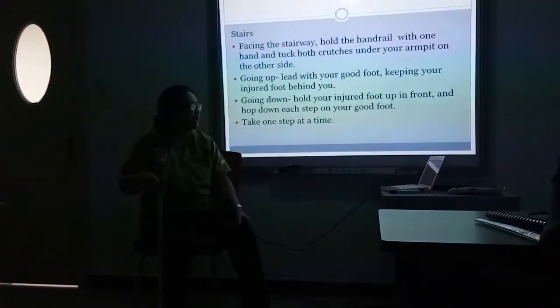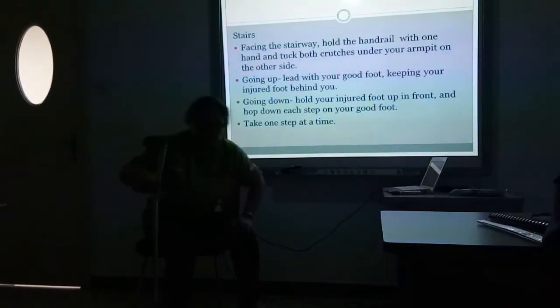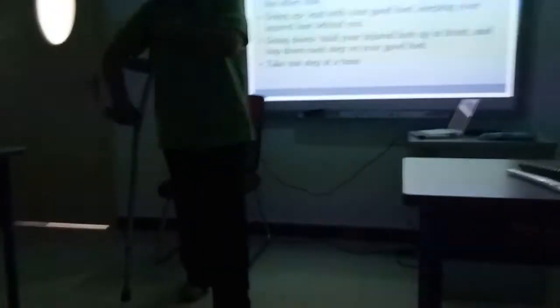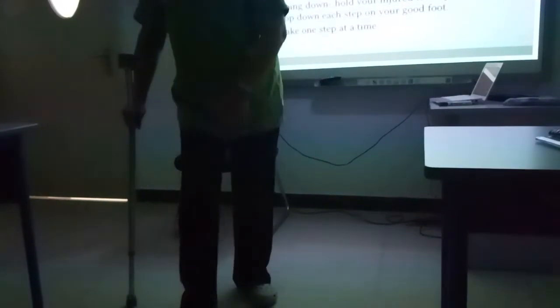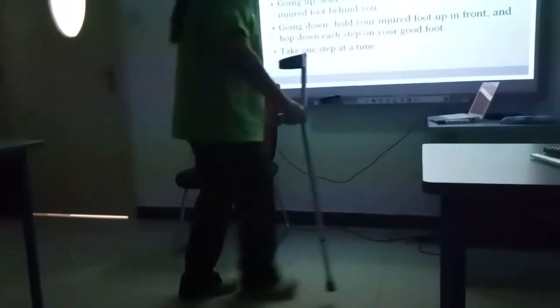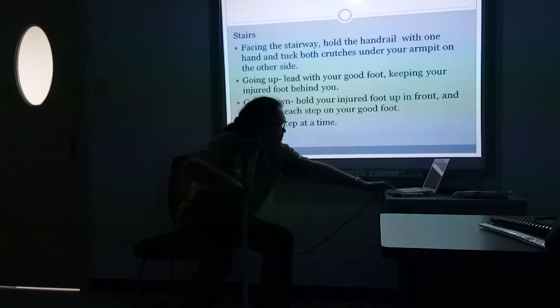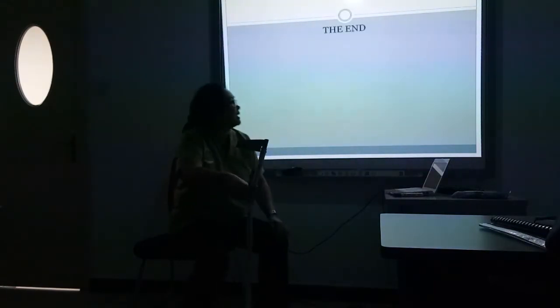Okay? Keeping your injured foot behind. So, pag itong injured, itong una mong iganyan sa stairs. Okay? Tapos, ito, ganyan. Ayan. Then, take one step at a time. Okay, hindi sabay-sabay, mahulog. Okay, yan.